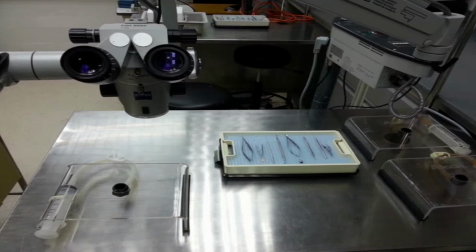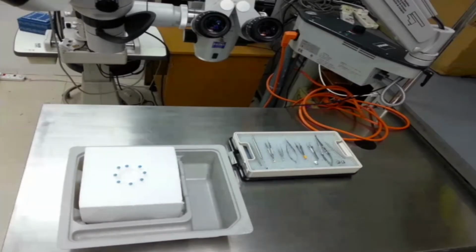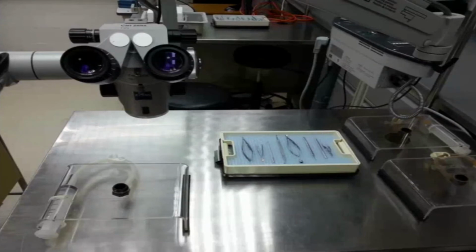In the wet lab, we also have something called an eye stabilizing device. It's called a Mandel. Basically, they use a vacuum to suck the eyeball that you purchase from wherever, so that you make the eyeball firmer for you to do keratoplasty surgery. It is a very good platform to practice. At least you know how to do corneal incisions and some suturing on the cornea as well.